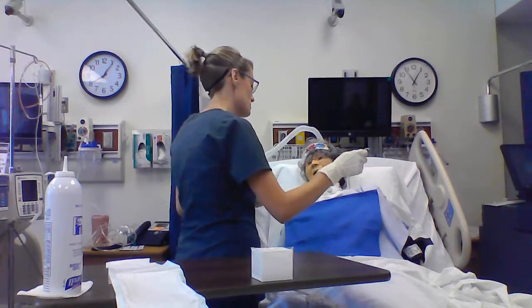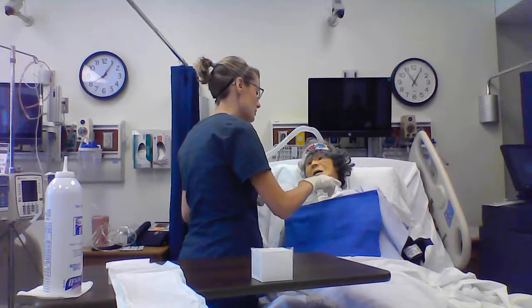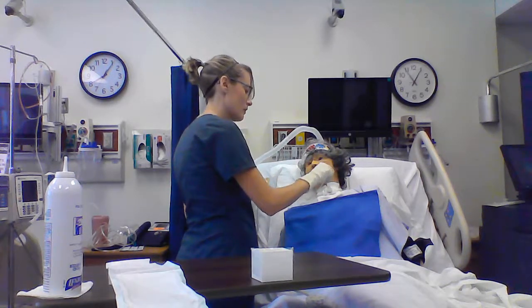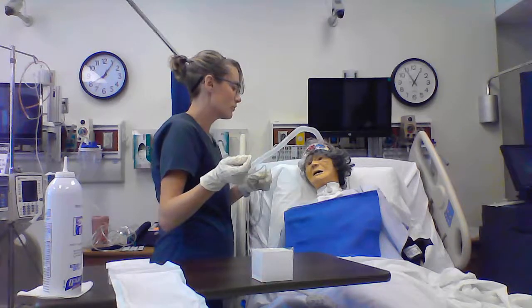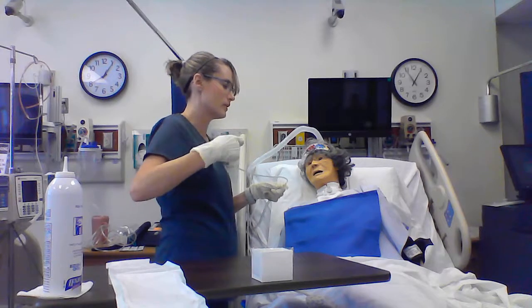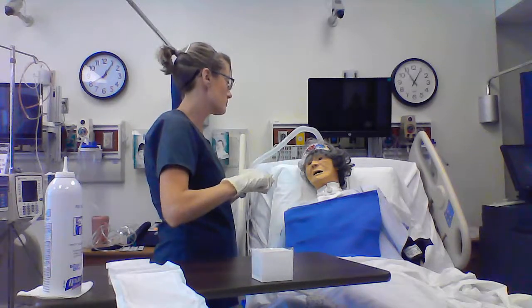But now I'm going to get started, and we're going to go down without suction to meet resistance, and then back up using intermittent suction, until her secretions have been cleared. She sounds much better. Her rate and rhythm of breathing is much better.